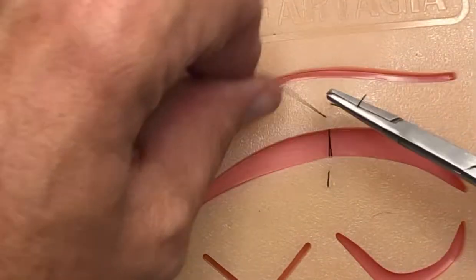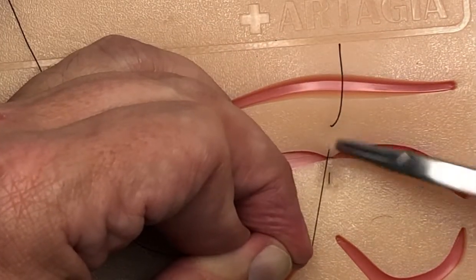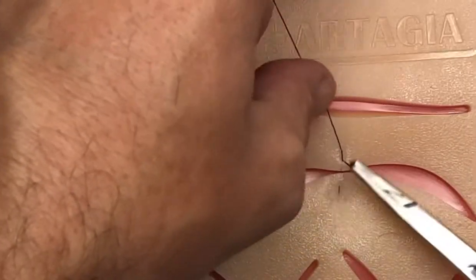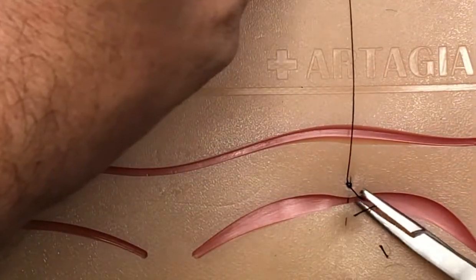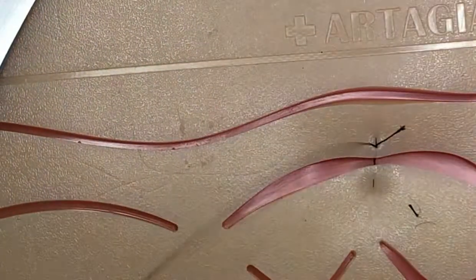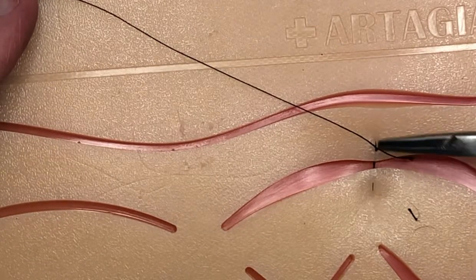You can see we've got the far-far-near-near, and when you tie this off you're going to be tying it on the same side. I'm going to do my instrument tie with two ties. No practice kit is a hundred percent perfect, but what you're trying to do is get into the habit of practicing your techniques with one of these practice suture kits, so that when you're ready to start working on real patients you've got the ideas and concepts down.